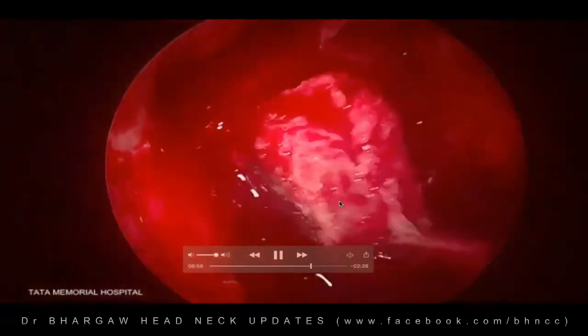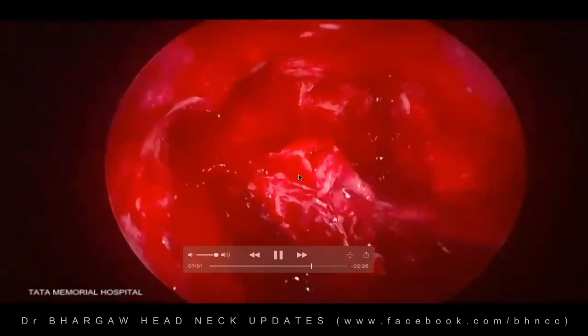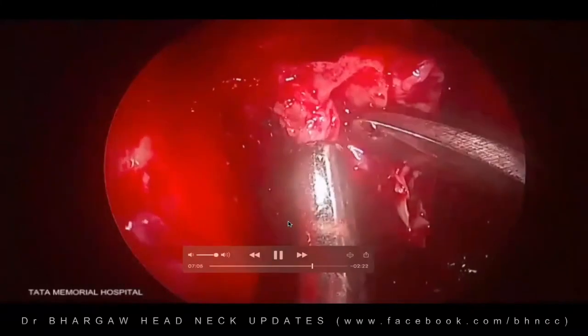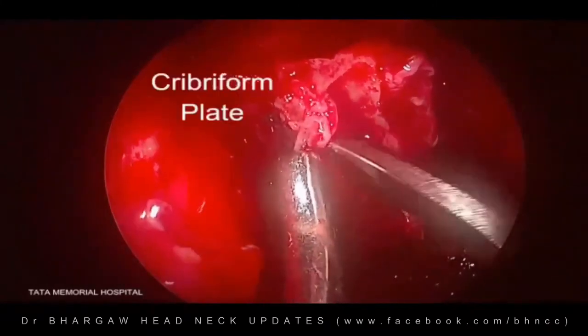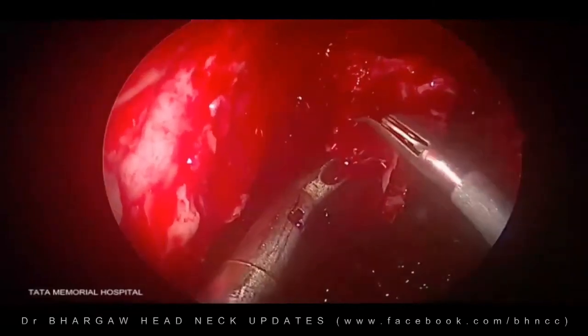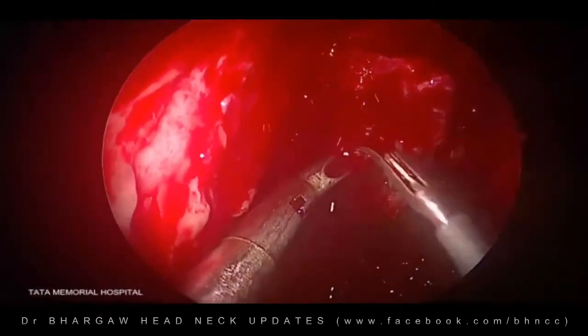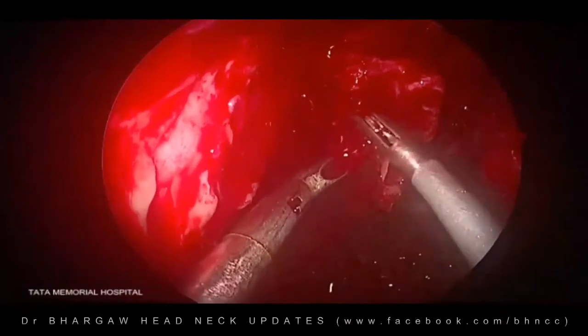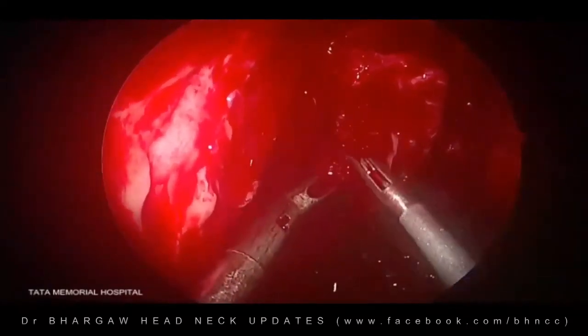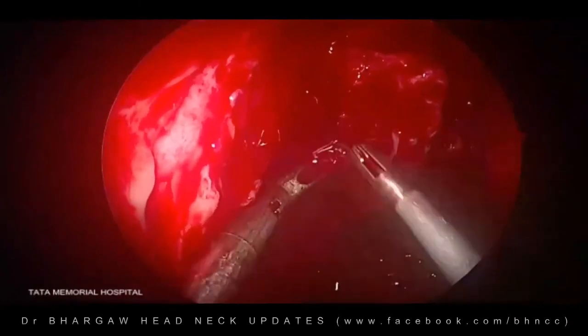Once you have done that, now you can just drill away this. The disease is only here in this area. The rest of the areas have been debulked. Now this cribriform area, this disease initially was there only on the right side. Just to make sure that there is disease there, we are sending that bit for frozen section to confirm that it is disease before proceeding, before opening the dura.